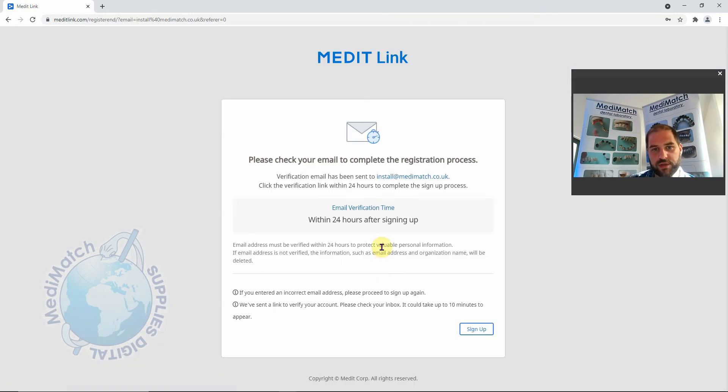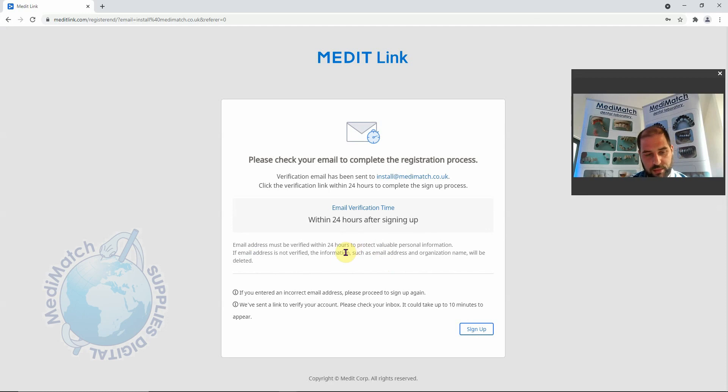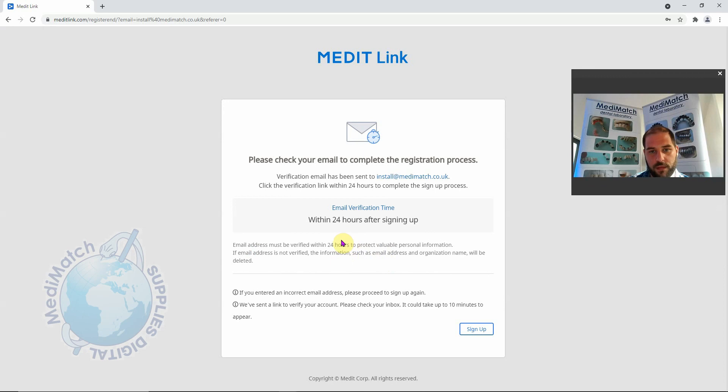This email will take usually about 10 minutes to come through. Once it does come through, we will click on the verification link that's in the email and that will bring us back to the Medit login page. I'll see you when that email comes through.